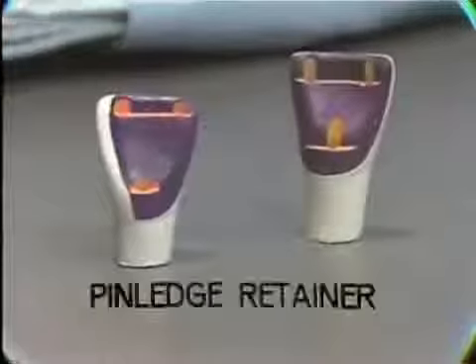Although the pin ledge retainer is described in the dental literature back in the 1880s, it was not until the 1950s, with the advent of rubber-based impression materials, that it became extensively used. And since that time, it has been increasingly used, and as we have already said, tending to displace the use of the three-quarter crown on anterior teeth. Two typical pin ledge retainers are shown on these models here.